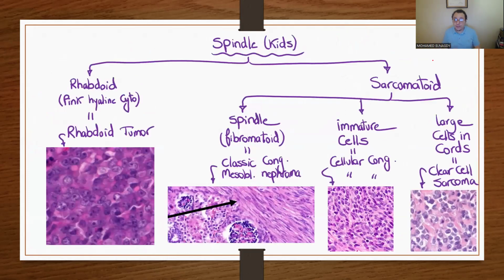This is the picture of angiomyolipoma. Okay, the spindle cells in the kids, which is part of the pediatric tumors section in the boards. But usually this pediatric section is dispersed across different specialties. You have a whole bunch of tumors scattered in different specialties, which come in pediatrics, and sometimes they are collected together in a subspecialty, pediatric pathology. It's one of the tough specialties, by the way. If you end up specializing in pediatric pathology, you are a rare thing. Like bone soft tissue, these kinds of things. Neuropath as well is not so attractive to most of the trainees.